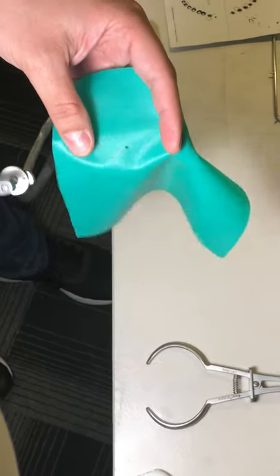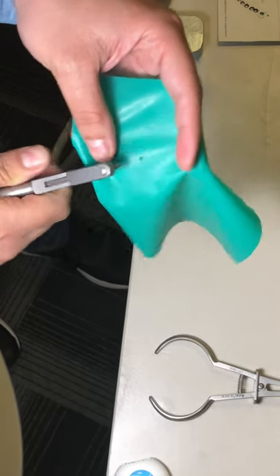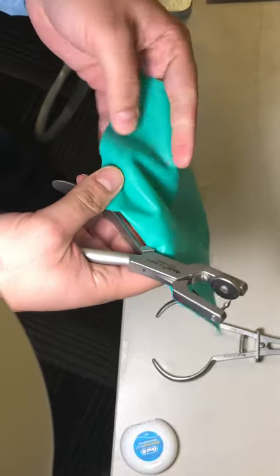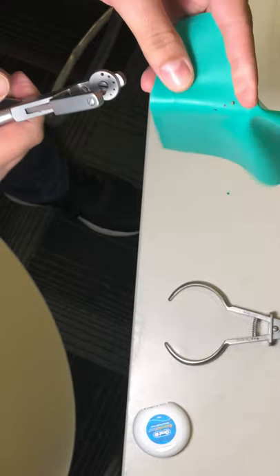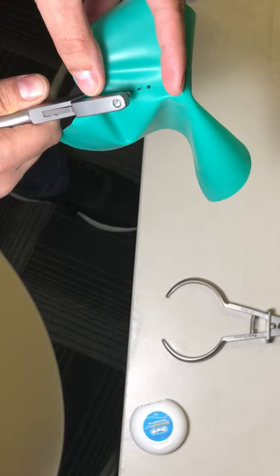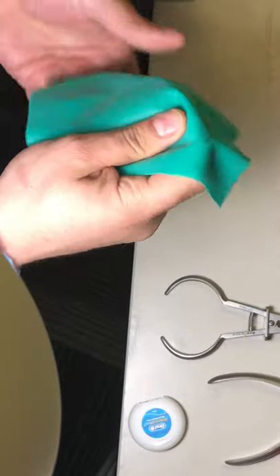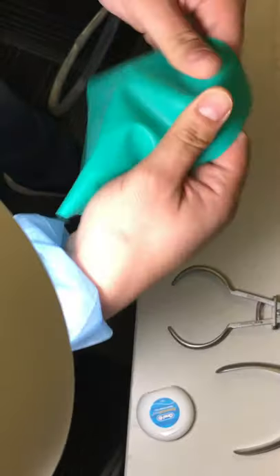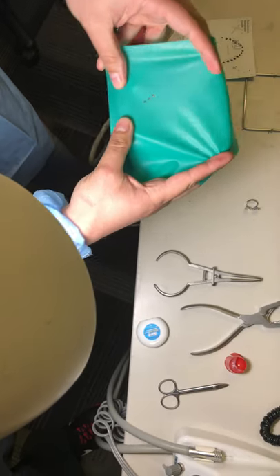We can do that with our bare hands in the clean area. We need to be sure that it's clear, and then we change to the pre-molar hole — the third one — and then the same one for tooth 44. We can do it fast because we have only ten minutes. Now we have three holes suitable for teeth 46, 45, and 44.